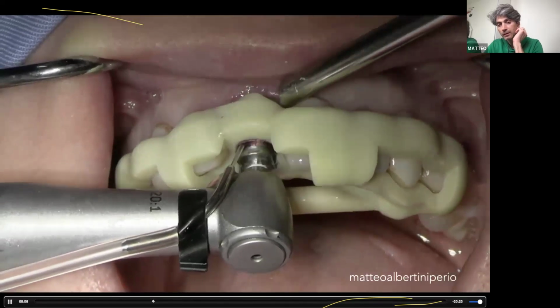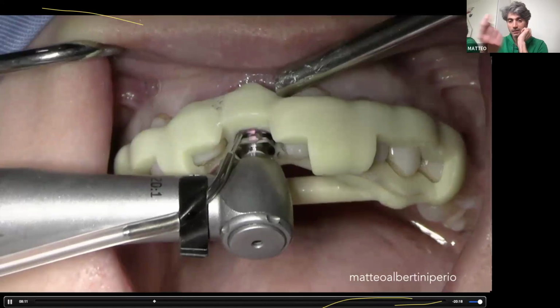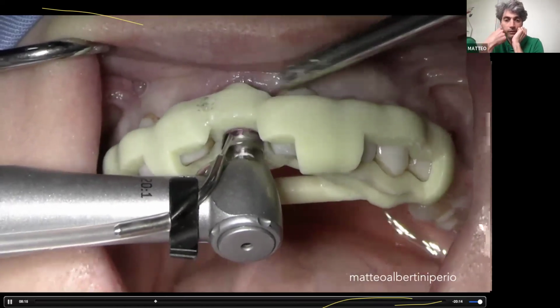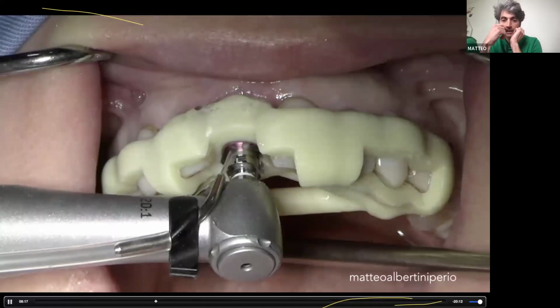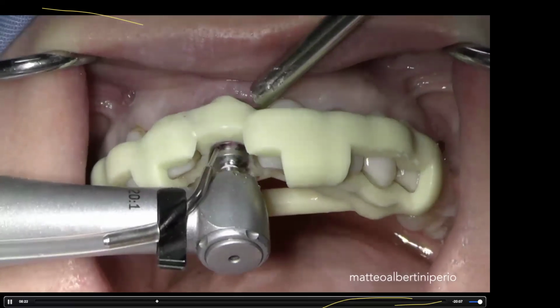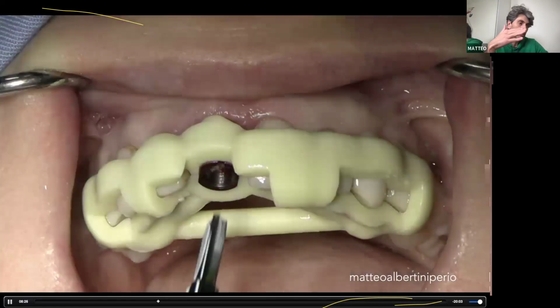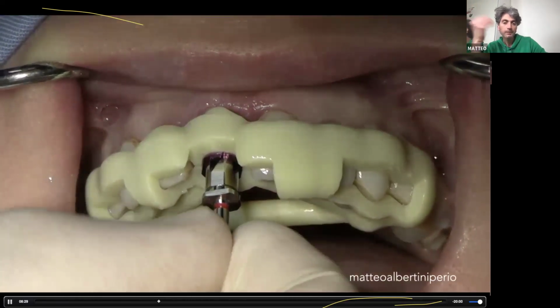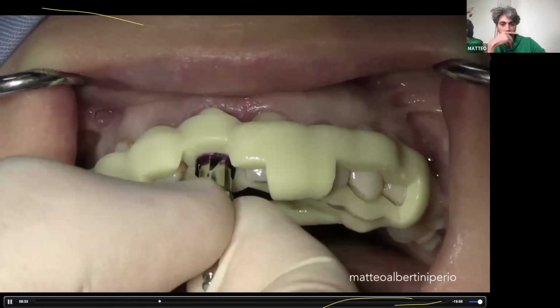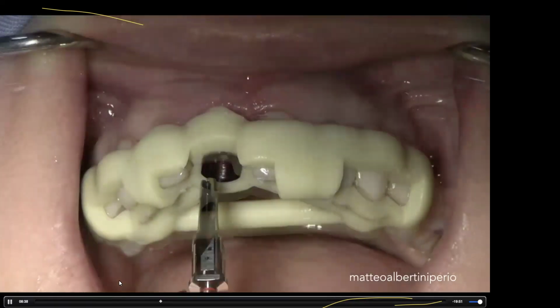Another important thing to me is that the speed of the motor of the handpiece is not to be very high. I used like 300, 400 rpm. The second important point is the rotation speed of the drill. On average, the speed I use is low, 300-400 RPM.